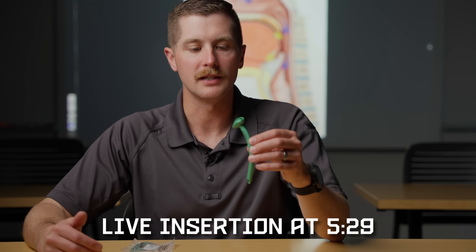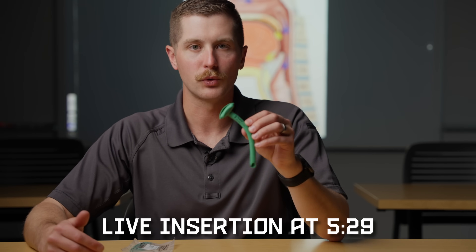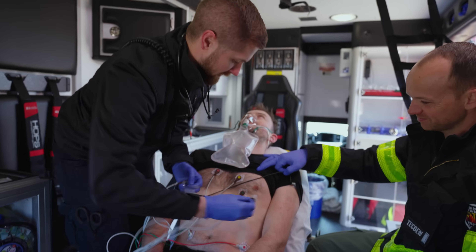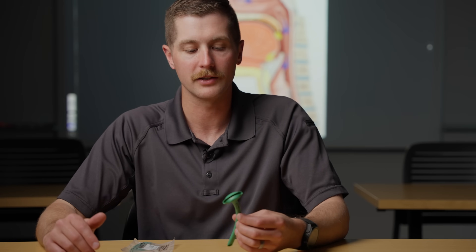A patient's tongue is the most common airway obstruction we see in EMS, and this is a very common tool that is used to mitigate that problem. This is a nasopharyngeal airway, also known as an NPA, and it's carried on ambulances, helicopters, you'll also see it in many military and SWAT IFACs, and then you'll even have it in some very well-stocked home first aid kits.